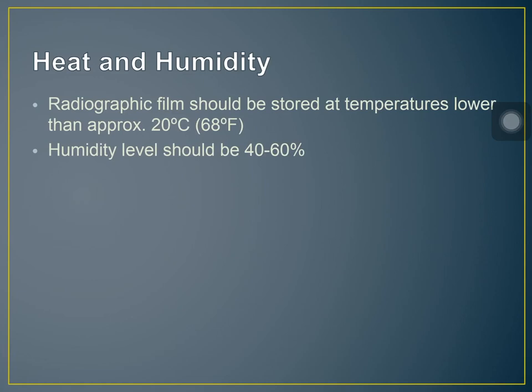So, storage under conditions of elevated humidity, pag sinabi natin elevated humidity, greater than 60%, because humidity level should be 40 to 60% only, also reduces contrast because of increased fog. So, static artifacts are possible when the relative humidity dips to below 40%.